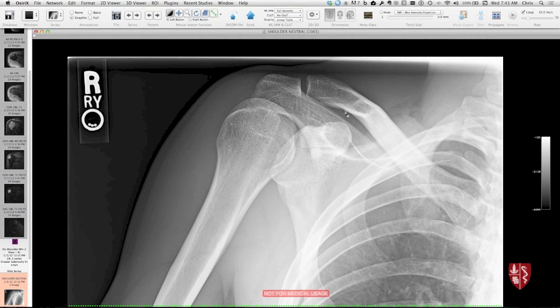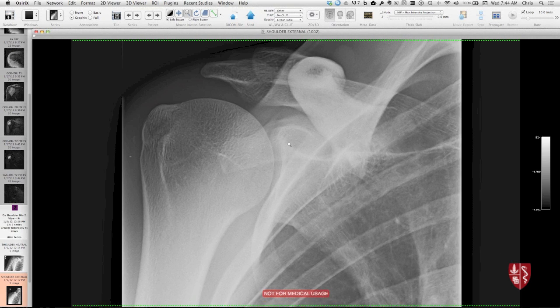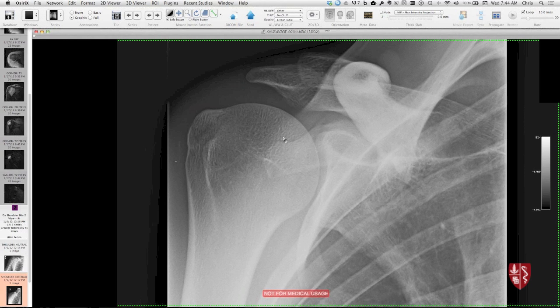A little bit more of a subtle case here. What type of view are we looking at — AP, Grashey, axillary? Right, just kind of an AP view. Humeral head is in internal rotation here. Here's the AC joint. When you see internal rotation, you can see this sclerotic line here — that should be the greater tuberosity of the humerus. The lesser tuberosity is in here, and then the bicipital groove is here. On the other view — kind of a Grashey view — we see down the joint, it's overlapping with the chest. Really don't see anything major abnormal here. If I zoom in a little bit and focus on the greater tuberosity, contours are pretty good, maybe there's a little bit of a lucency in here, but it's really tough to see any definite abnormality.